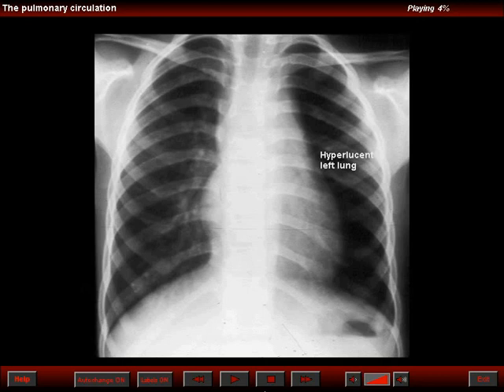In this patient, the left lung was oligemic. Are we dealing with a ball valve mechanism, that is some sort of obstructing lesion of the proximal airway, like a foreign body or a tumor, or are we dealing with a primary vascular insufficiency? The patient gave no history of pneumonia, and there were no respiratory problems.